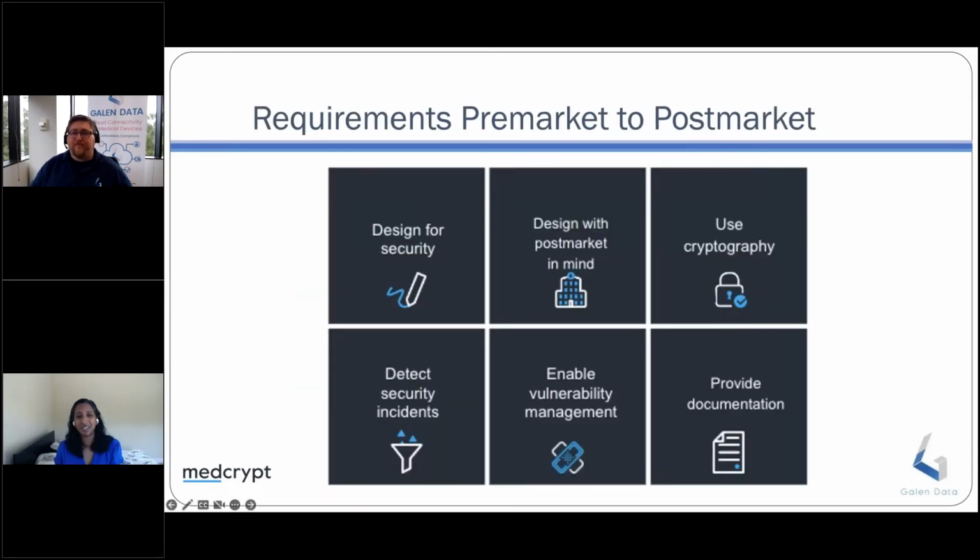So this is an interesting thing to think about with the regulators. When you look at devices in particular, or healthcare in totality, you would think there'd be a single entity that really had regulatory authority over the totality of the ecosystem. The reality is that's not the case. A lot of times you'll hear regulators talk about collaboration and how we all need to share with each other, and it'll sound like a nice to have and optional.